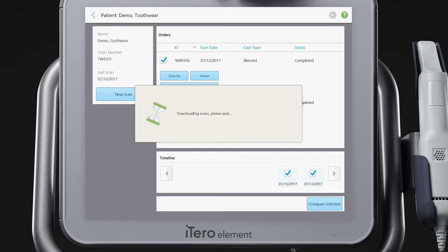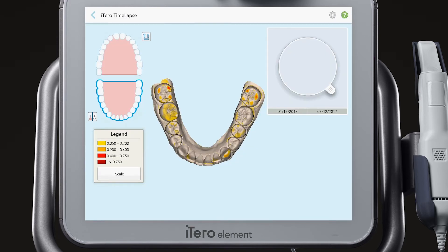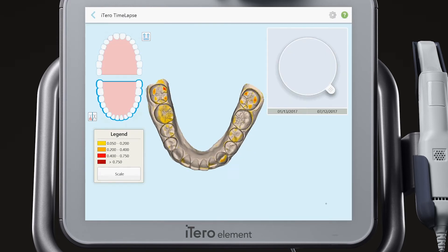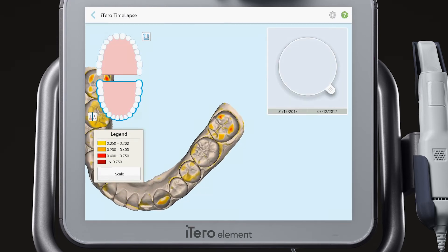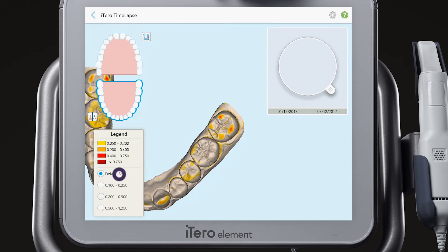Notice the changes that are highlighted by the color corresponding to the color legend in the lower left corner. The color legend is in millimeters. You can adjust the measurements by tapping on Scale.